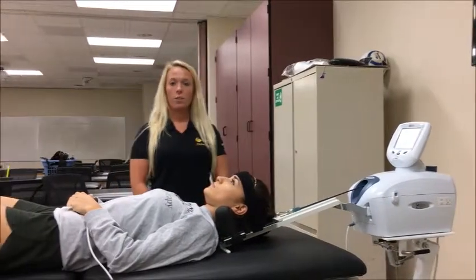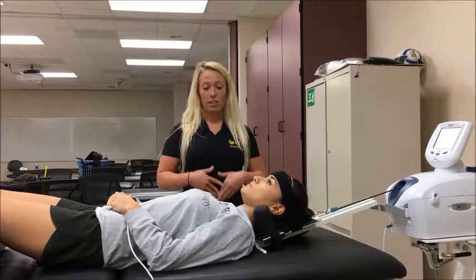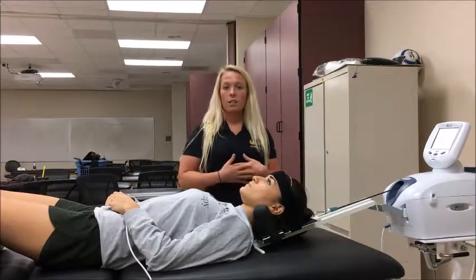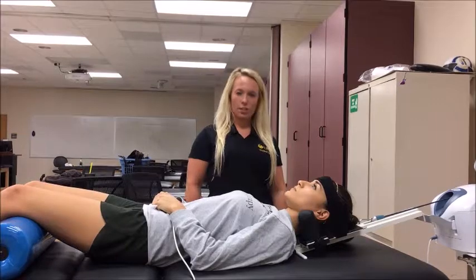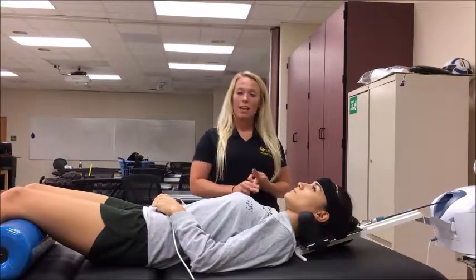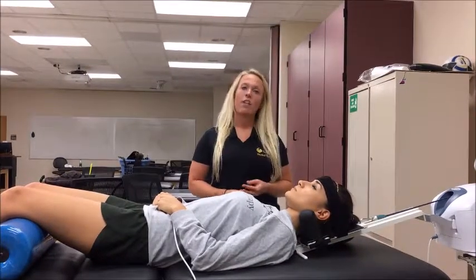Make sure to closely monitor the patient while treatment begins for at least the first 5 minutes. You want to monitor to make sure that there's no peripheralization of symptoms, pain, and that the patient's comfortable. The expected outcomes of this treatment would be decrease in muscle spasms, decrease in pain, and increased active range of motion for both cervical rotation and lateral flexion.